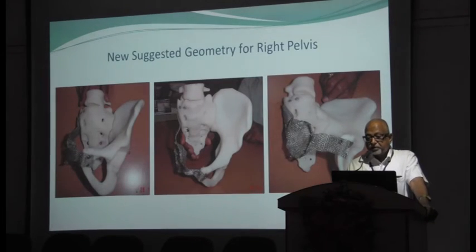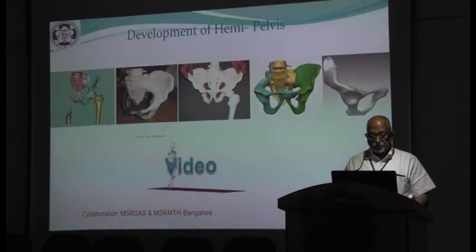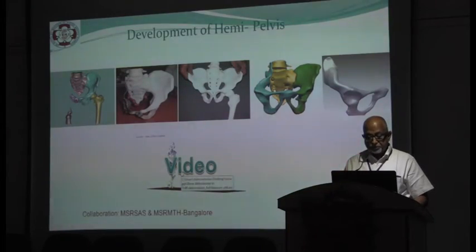And then we converted that into a model which was done using 3D printing technology.